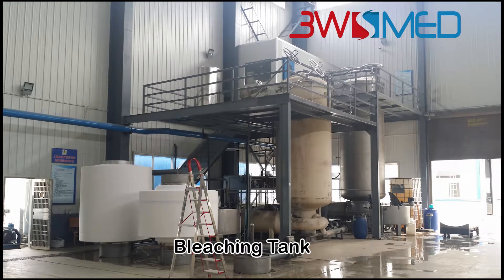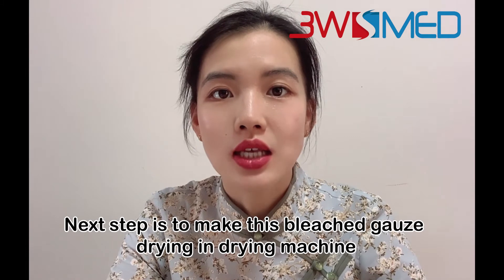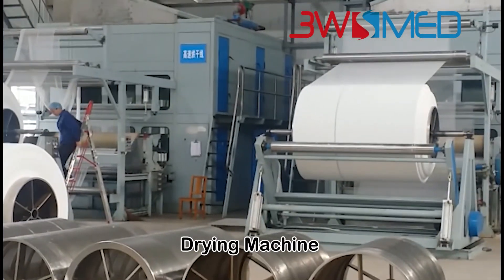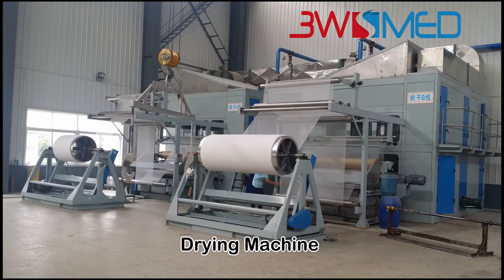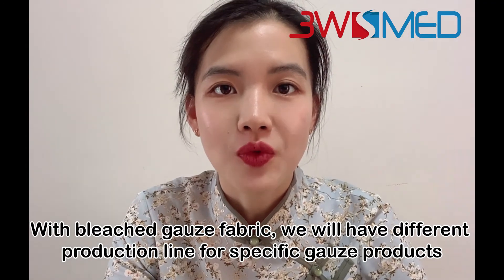The next step is to dry the bleached gauze in a drying machine. So this is how to produce bleached gauze fabric from warping, weaving, bleaching, and drying.